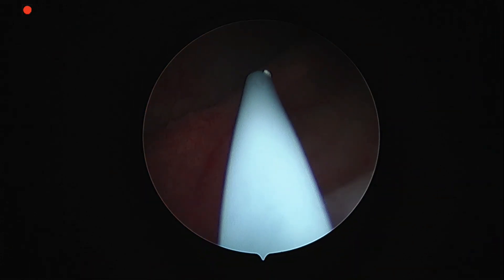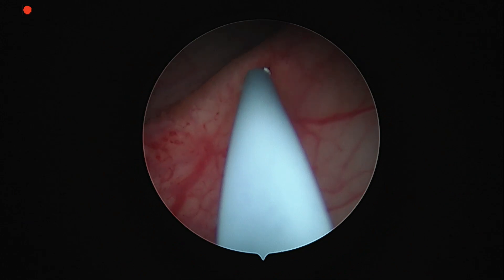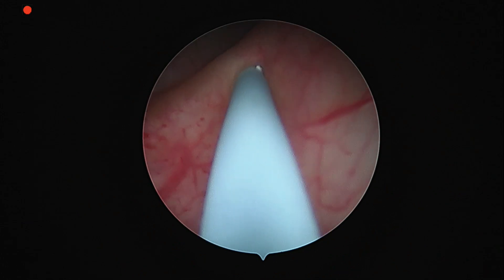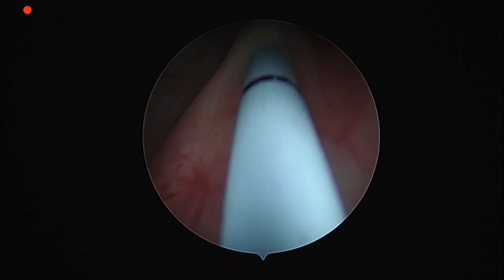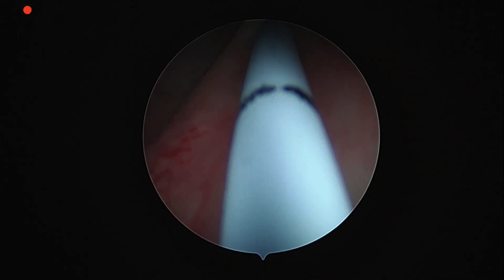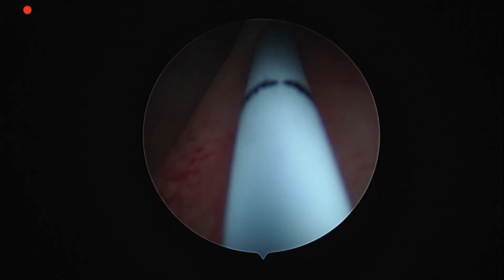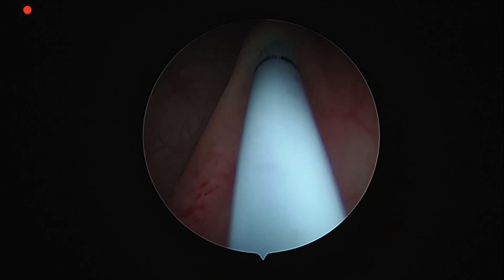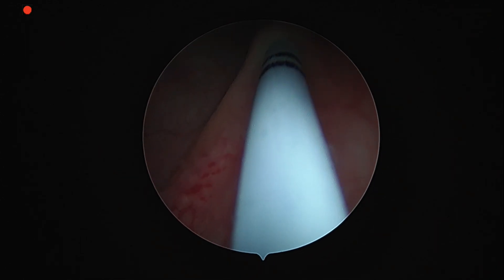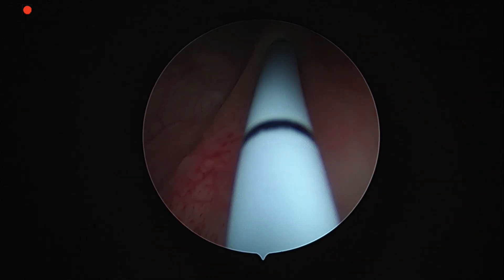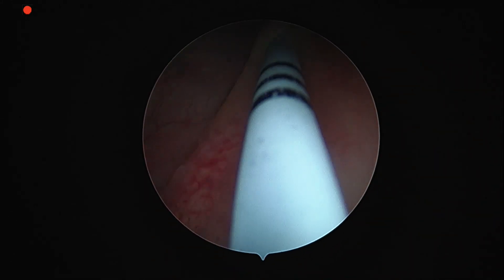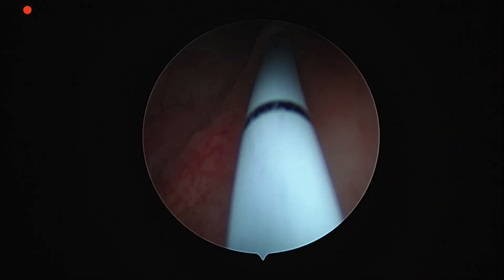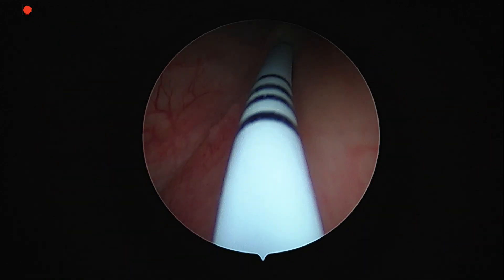The first step is to do a cystoscopy and guide a 5-French ureteric catheter into the left ureter. When there is a 2-line marking, it indicates we have reached 10 centimeters. Since the ureter is 20 centimeters, we push it until 20 centimeters. When the 4-line marking comes, it is 20 centimeters.